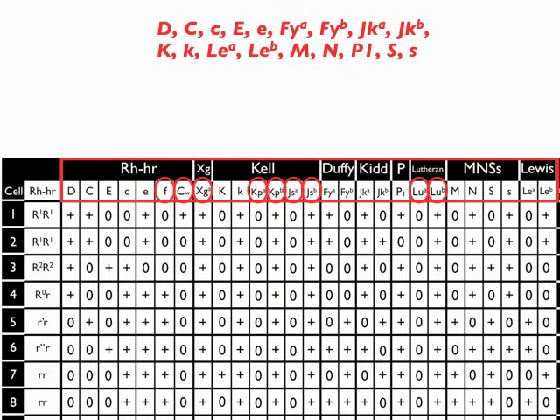On the other hand, there are some high frequency ones that are there in virtually every cell, such as JSB and KPB, for example. And those can be ruled out in the vast majority of situations. So again, very important to recognize that. Also important to know that in some cases, especially when you're looking at panels from some of the newer manufacturers in the market in the United States, it can be difficult to find licensed anti-sera, especially to some of these high-frequency antigens, such as KPB, for example. So you may see something that looks kind of like this, where you actually have asterisks there instead of pluses. You assume that all of them are positive because that's generally true, but you don't know that for certain because they don't have the anti-sera to test it.